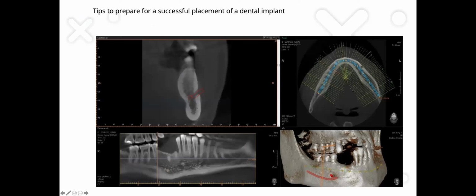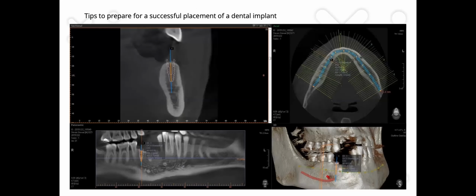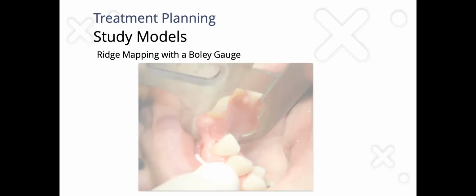And then here we can actually see in 3D imaging, when you're taking these transverse slices in 1 millimeter sections, you actually see the mental foramen protrude there. So relative to the mental foramen, you could see how you place your implant there. You can actually see the diameter and the length that you have freedom to choose for your implant size.